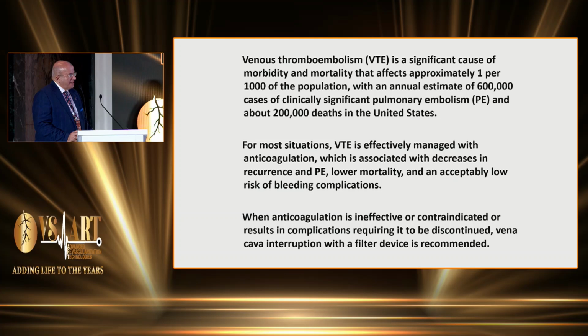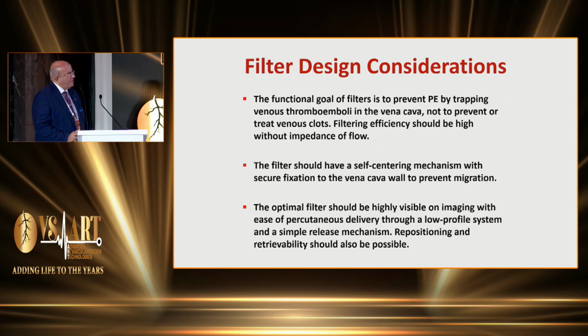But unfortunately, in some patients there is anticoagulation inefficiency or contraindication, or it results in complications requiring it to be discontinued. In this situation, vena cava interruption with a filter is advised or recommended.